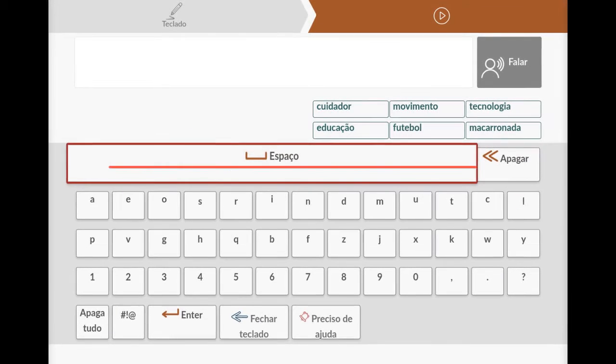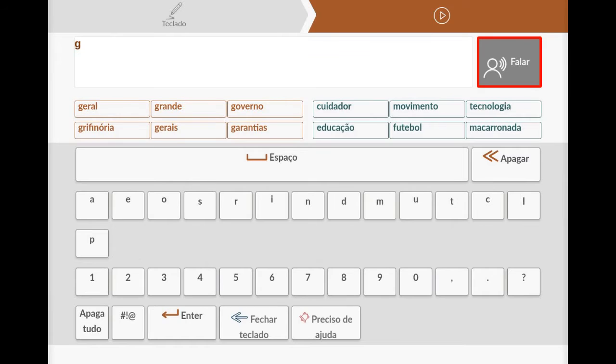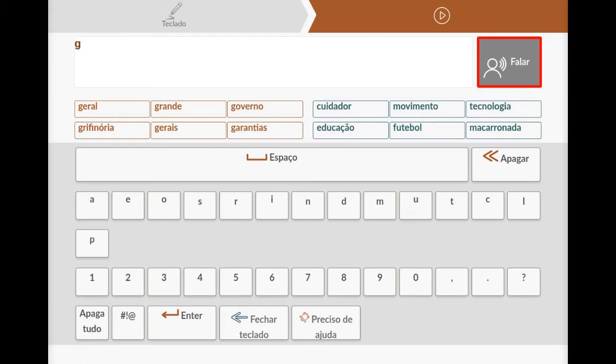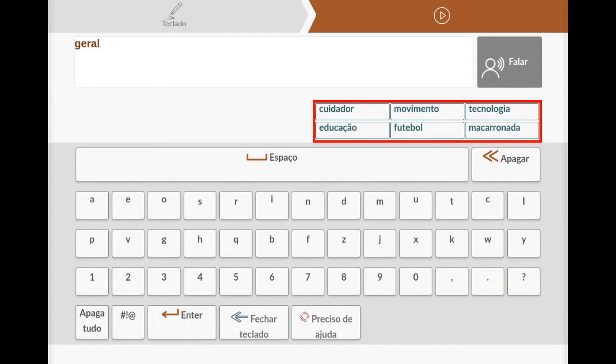That's the reason why we are doing this, and that's the reason you're seeing this red rectangle moving around the screen. We have developed a system that uses the computer's webcam to detect the user's eyes and also detect when the user is blinking. The blink tells the software that a selection was made, and the user wants to interact with that particular selected item. And that was how we did it.